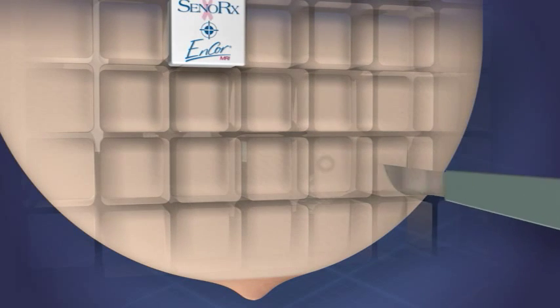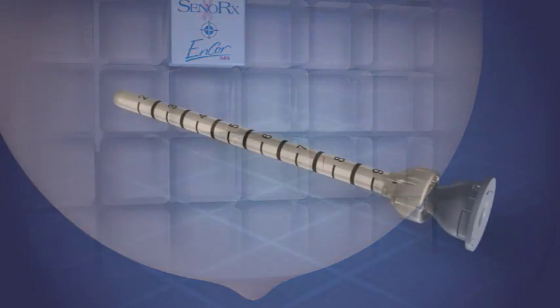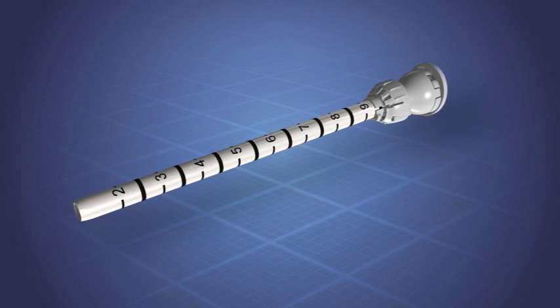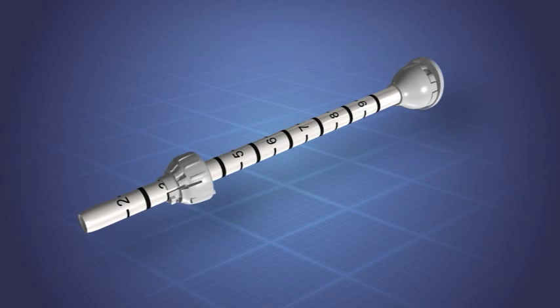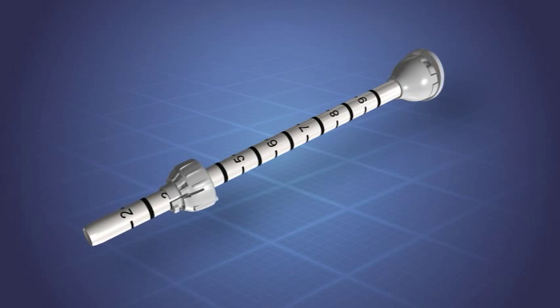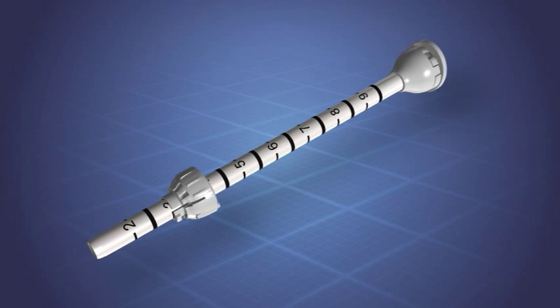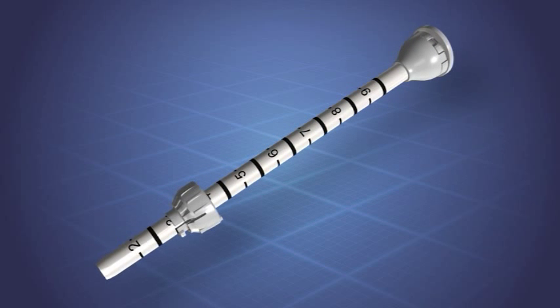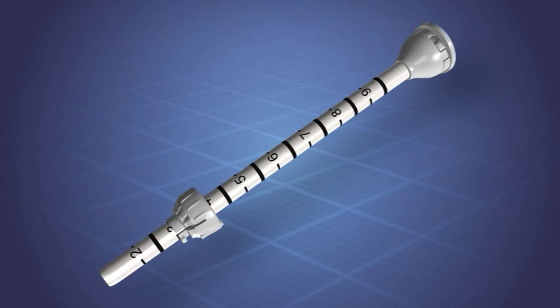A skin nick is then made in the same location. The pre-determined depth to the region of interest is then set on the Encore coaxial cannula by positioning the leading edge of the depth stop. It is this final position of the depth stop that maintains access to the region of interest for all of the Encore interventional instruments during the procedure.